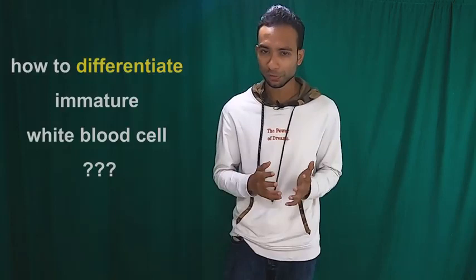Metamyelocytes. When we consider metamyelocyte, it is easy to identify because it has a kidney-shaped nucleus which takes half of the space from the cytoplasm. Also, nucleus to cytoplasm ratio is low.